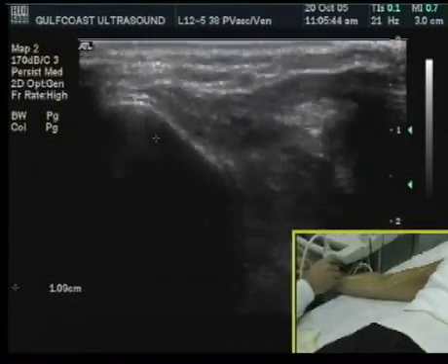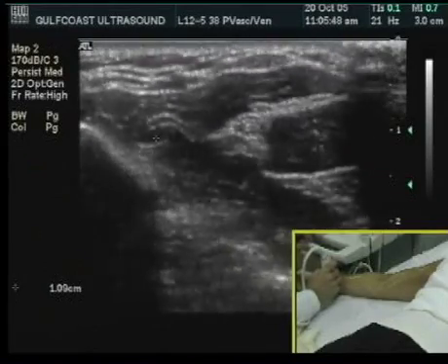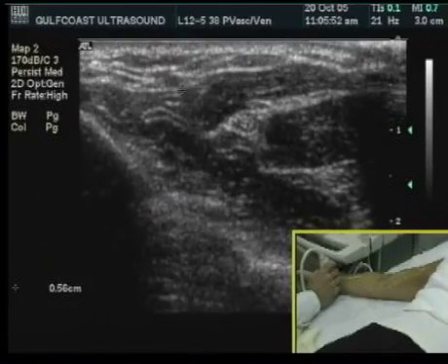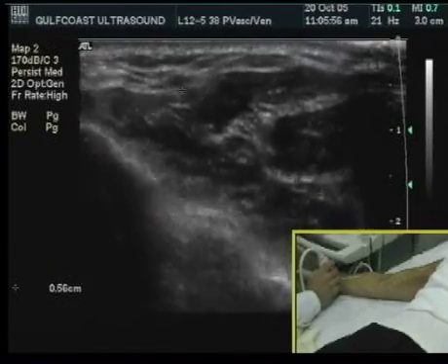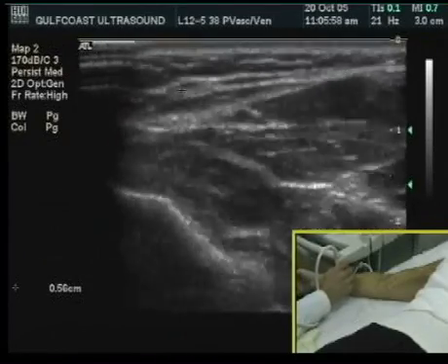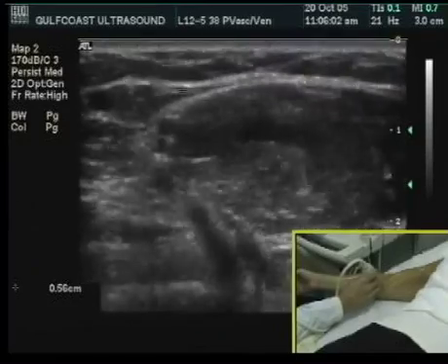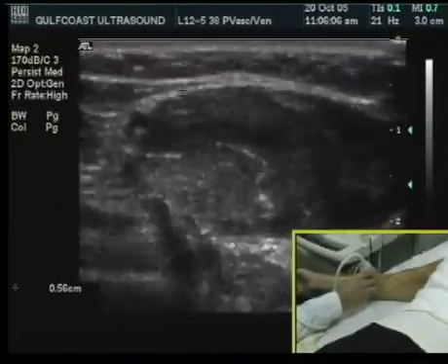turn your attention down to the wrist and identify the radial artery right at the wrist level. Here it is here. I'll just press on it a little bit to make sure it's not a vein. Doesn't collapse. You can see the radial veins right beside it, and I'll follow this radial artery back up carefully all the way back up to the brachial artery.